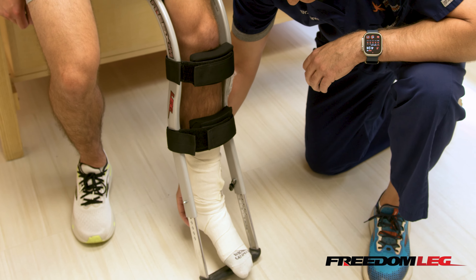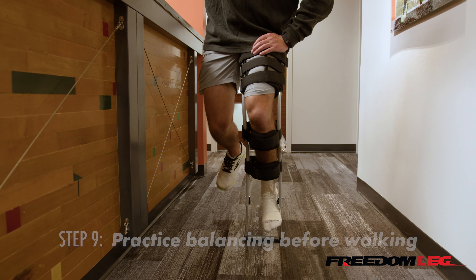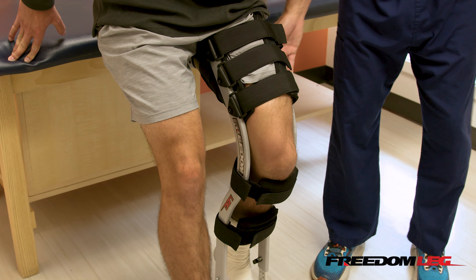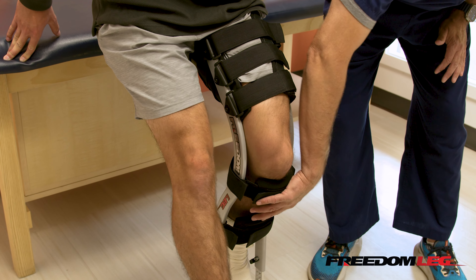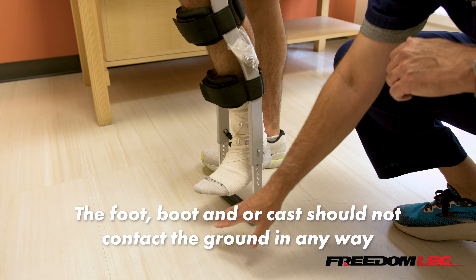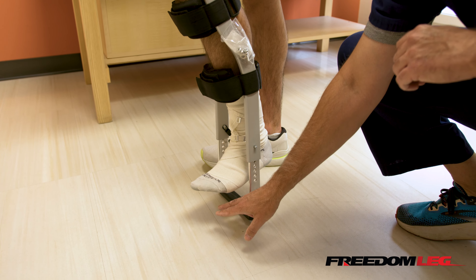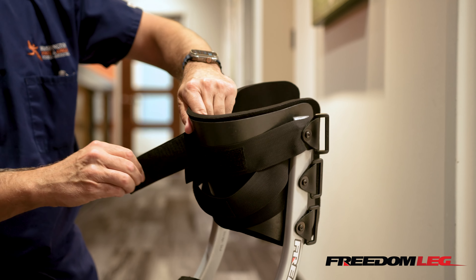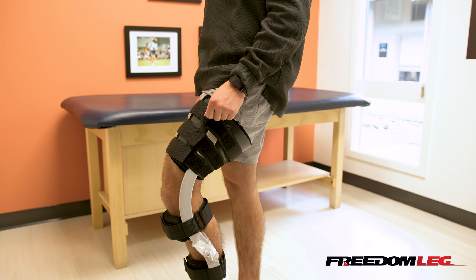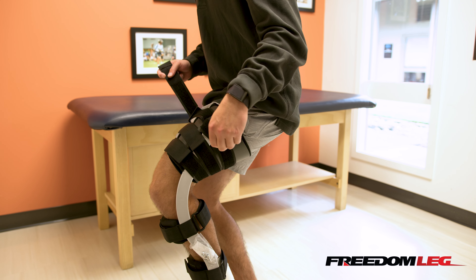Fit the freedom leg with your foot pointed down. Now we're ready to stand up. The first time, push off on something, hold onto the table, bring your other foot off the ground and balance, and feel that pivot point. You're going to feel tension on the back of the thigh and on the front of the shin. We're looking for some clearance that allows your post-op boot or splint or cast to clear the ground so you're not bearing any weight. We can adjust the top strap to increase the angle between the thigh and the lower leg — the thigh cuff will pivot around the bottom screw. Bodhi's going to undo the top strap, undo the bottom strap, slide down — you see the cuff pivot — then reattach the bottom strap and the top strap.